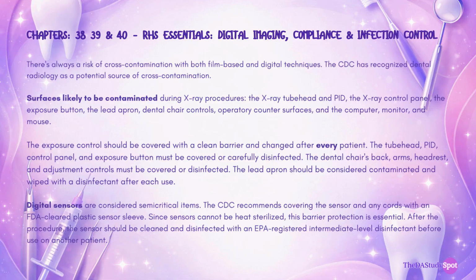The tube head, PID, control panel, and exposure button must be covered or carefully disinfected. The dental chair's back, arms, headrest, and adjustment controls must be covered or disinfected, and the lead apron should be considered contaminated and wiped with a disinfectant after each use.